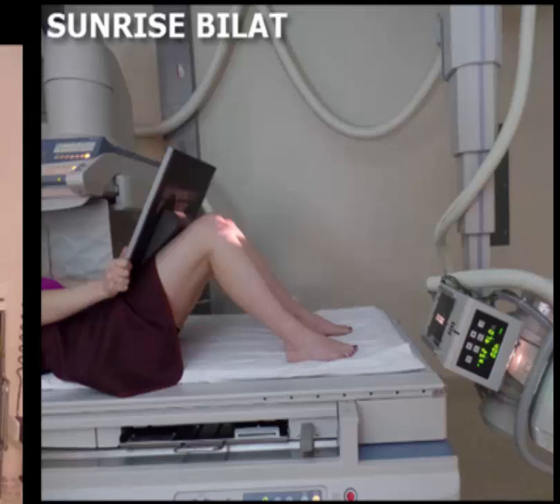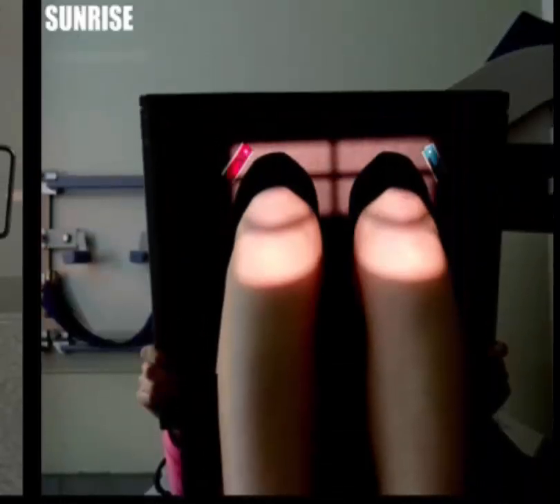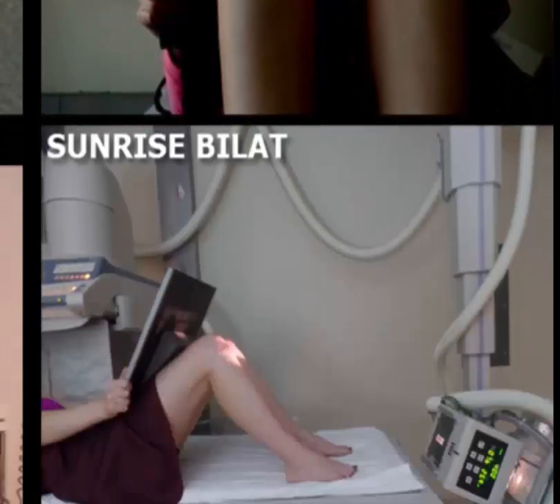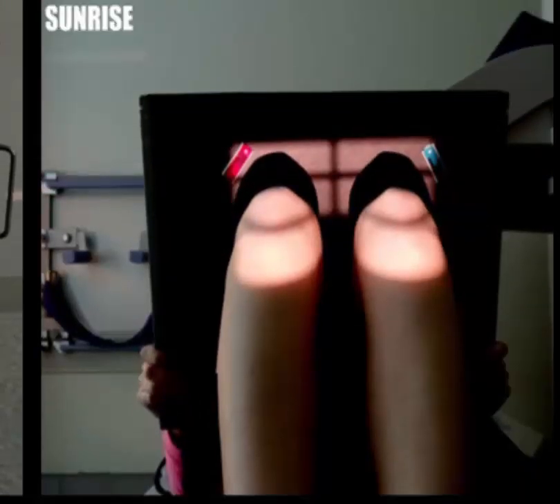Although the knee joint flexion may vary from patient to patient, ensure that both knees are at the same height or level. Direct the central ray through the patellofemoral joint space. You will want to have the patient also hold on to the cassette for you. Sometimes you may choose to also use a radiolucent sponge to hold the image receptor in place. Remember, once again, use both right and left markers and collimate tightly as seen here.